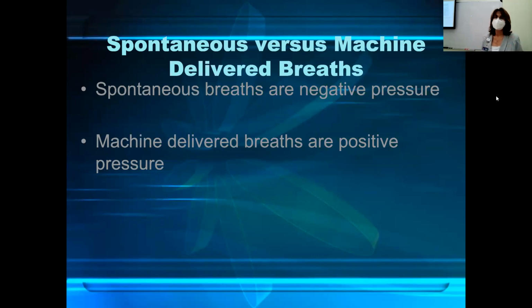When a patient is not breathing well enough on their own, whether they've had damage to their brain, or they have some sort of neuromuscular disease, and now they're no longer able to get air in and out of their lungs, how do we get the air in? The most common way is pushing it in. So pressure builds up when we push air into the lungs.